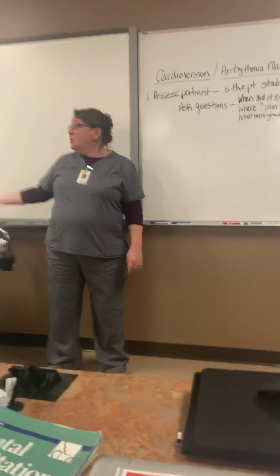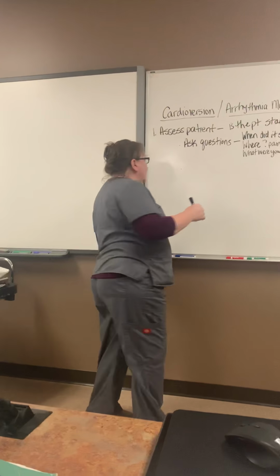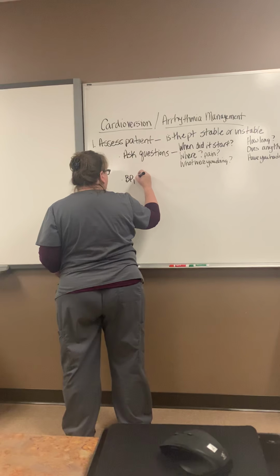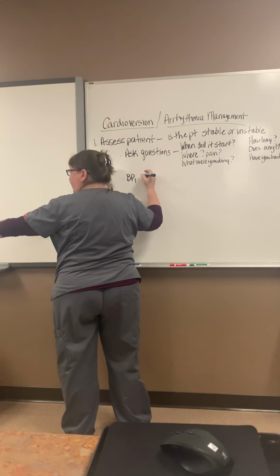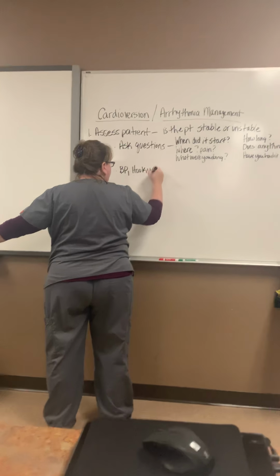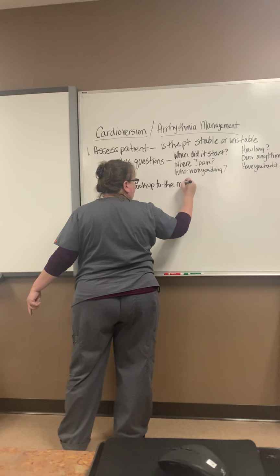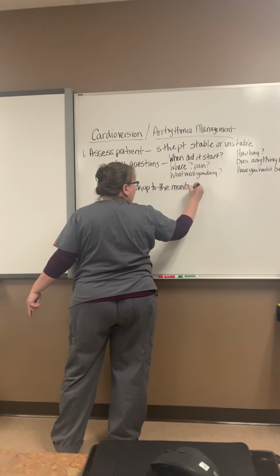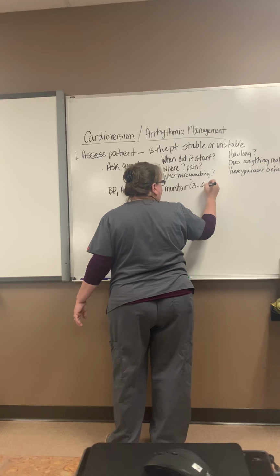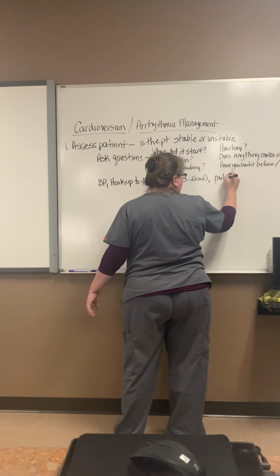So while we're asking questions, what else are we going to be doing? We're going to do a blood pressure. We're going to hook the patient up to the monitor, the 3 lead, which I'm going to show you. Pulse ox.